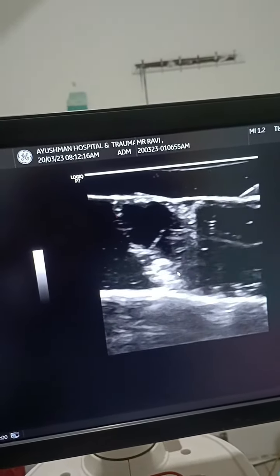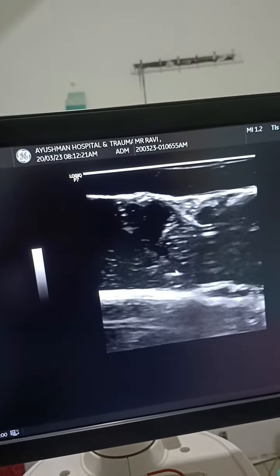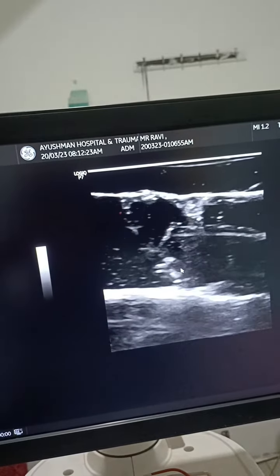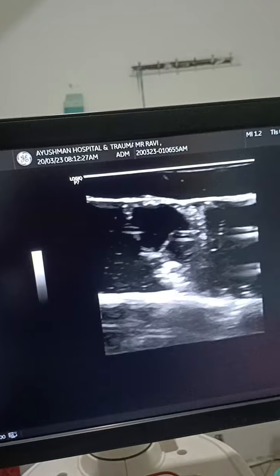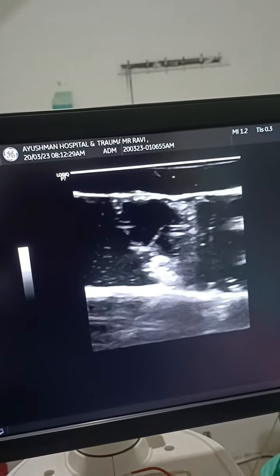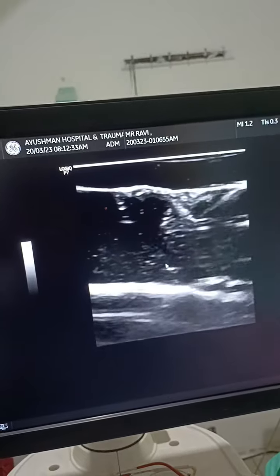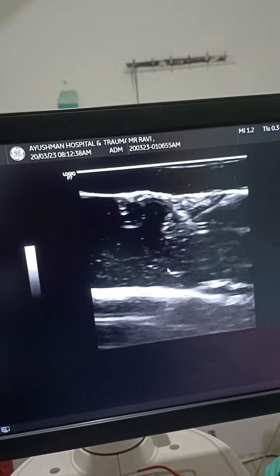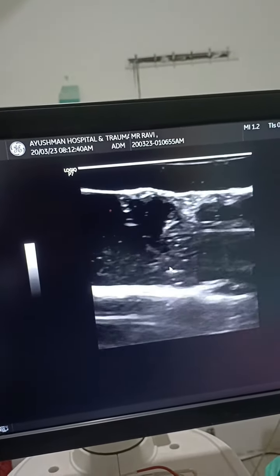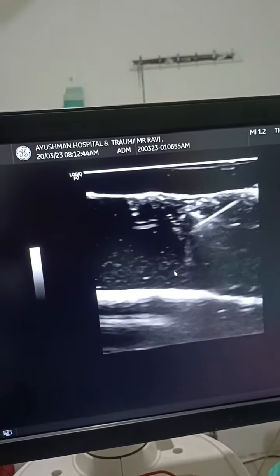Micromovement. You have to visualize deep all the time. So here, this is our brachial plexus.